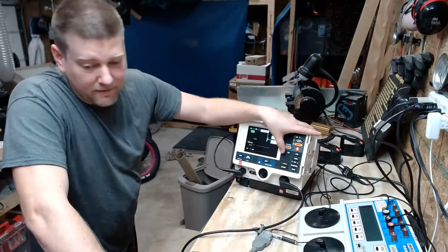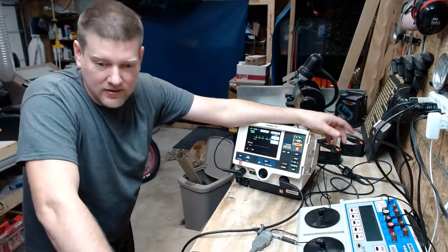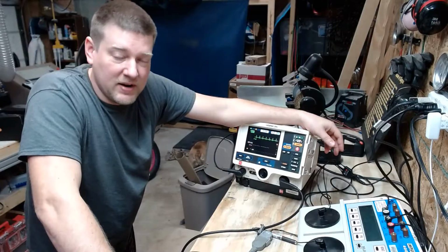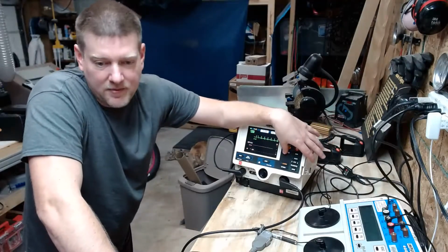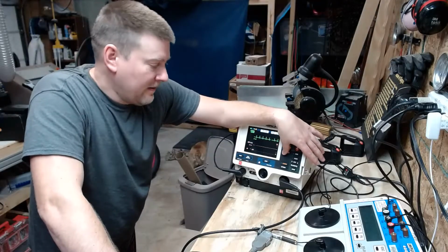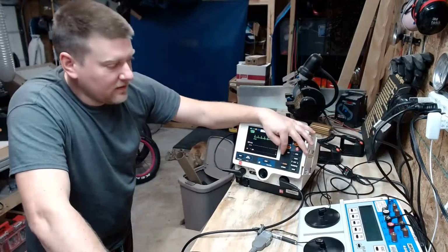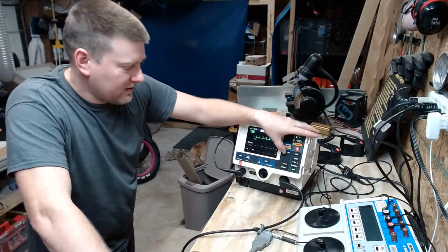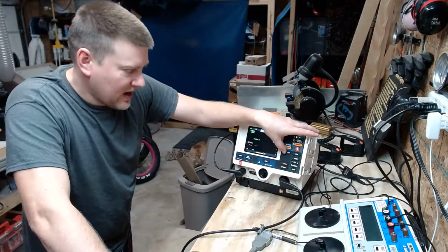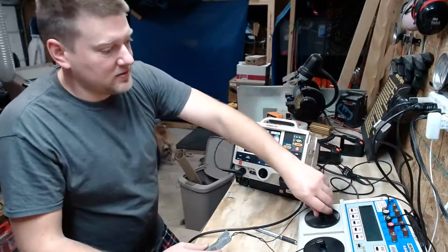Now, I can tell you for a fact that I have gone into a surgical room when the anesthesiologist is tripping out, the cardiologist is tripping out, because they can't pull up the patient. It's just a flat line, and this patient is very much so not a flat line. And it's the lead button. They bump it, they do whatever, and if it's not on the correct setting, then you're not going to get the correct results.